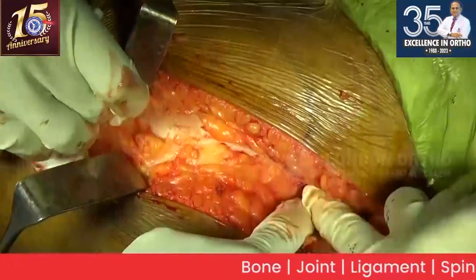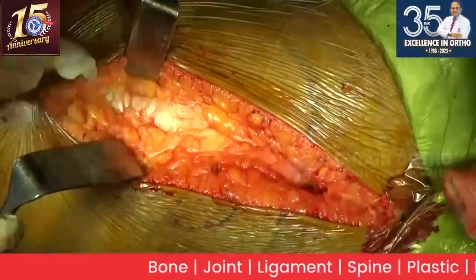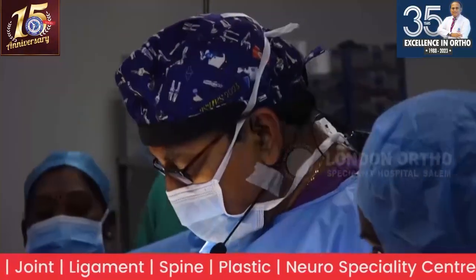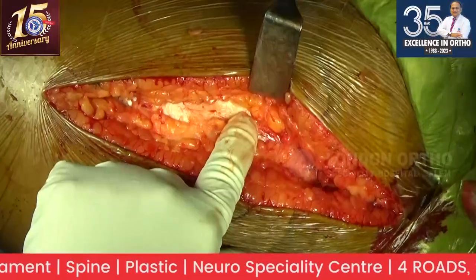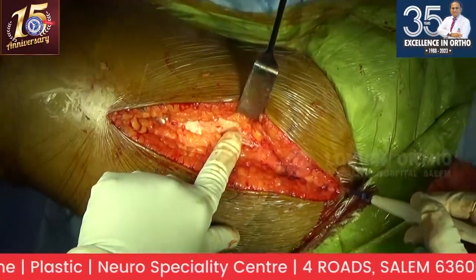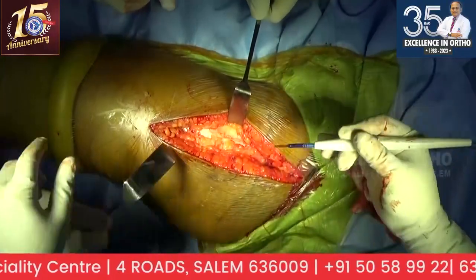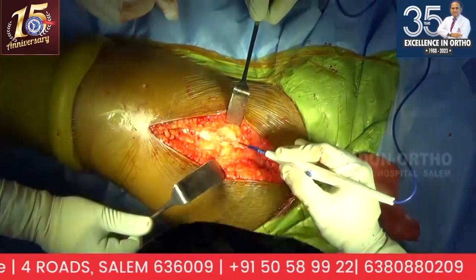Patient on lateral position. This is the head end. You can see that. Young lady, you heard the history. So this is the tip of the greater trochanter, 4 inches above and below. This is almost double my usual incision. For the demonstration, I have done this.